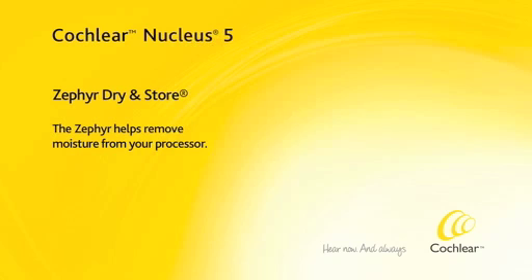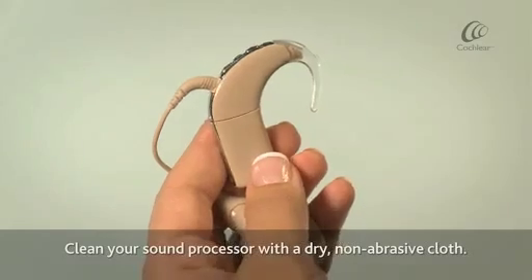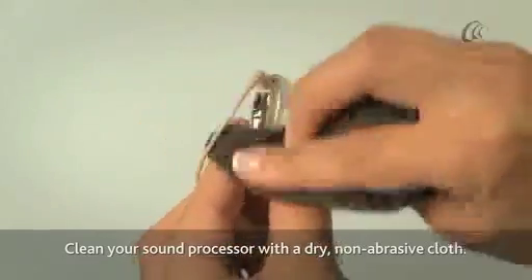The Zephyr Dry and Store helps remove the moisture from your processor. Clean your sound processor with a dry, non-abrasive cloth.